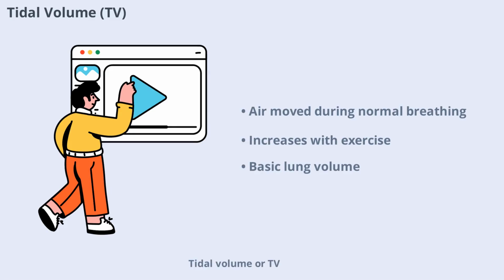Tidal volume, or TV, is the amount of air inhaled or exhaled during normal, relaxed breathing. It's the air you move in and out with each breath at rest, but it can also increase during exercise or other activities that require more oxygen.